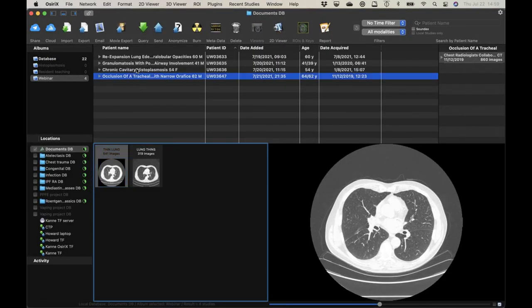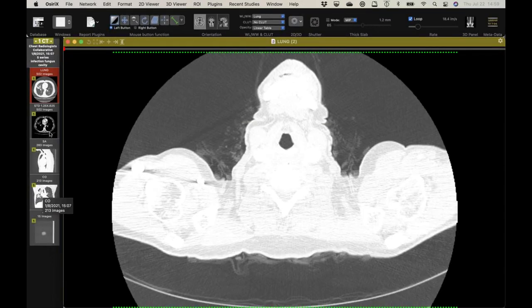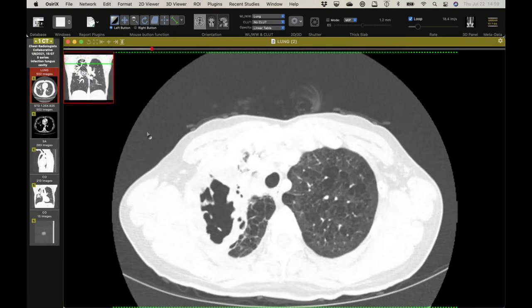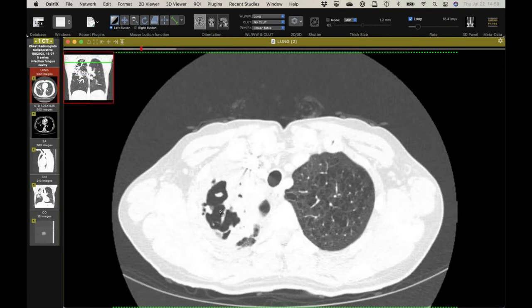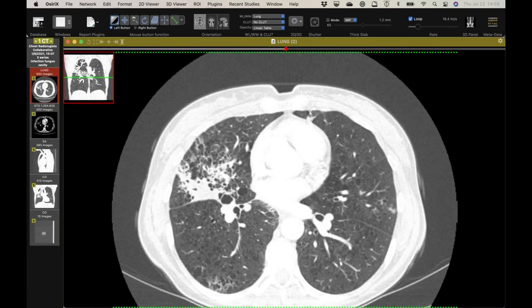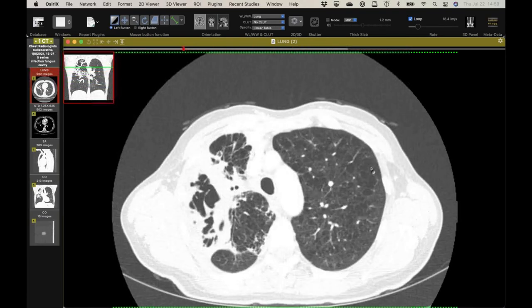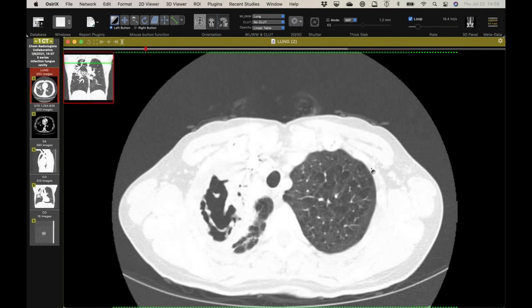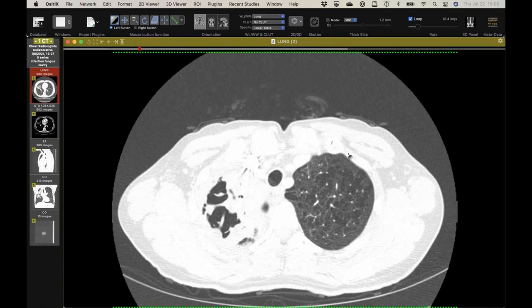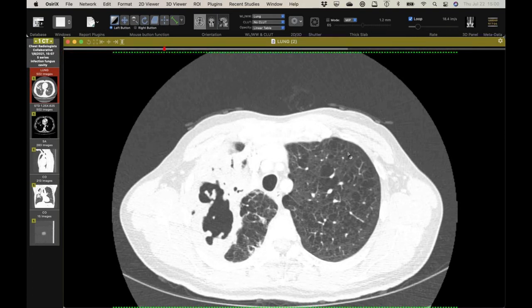And then last, and I don't remember if I've shown this case, I don't think I did because I came across it late last week. But this is a good companion case to David's case. So this is a patient, former smoker, bad emphysema, who developed this cavity in the right upper lobe, very ugly looking with all this dense consolidation and then consolidation elsewhere and endobronchial spread. So a good look for tuberculosis, non-tuberculous mycobacteria. So this was worked up, and this actually ended up growing out histoplasmosis. So this is a case of chronic histoplasmosis, which is very uncommon.